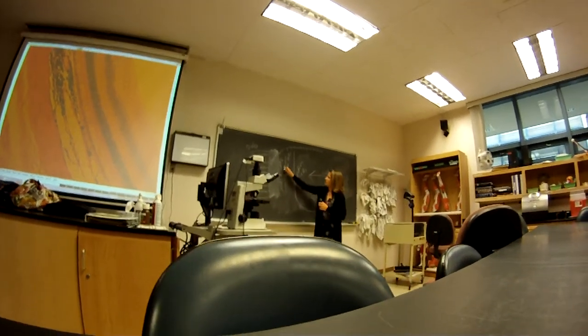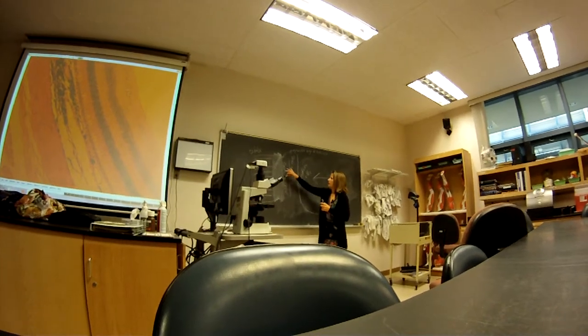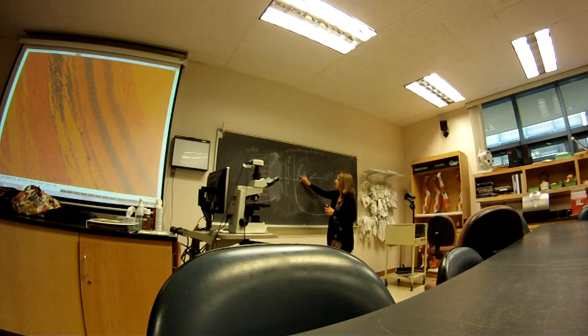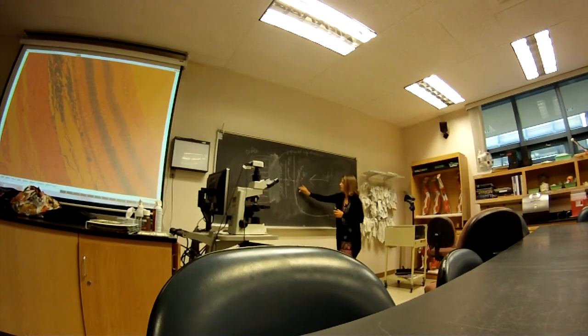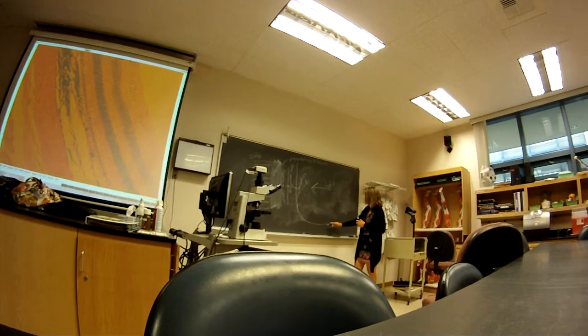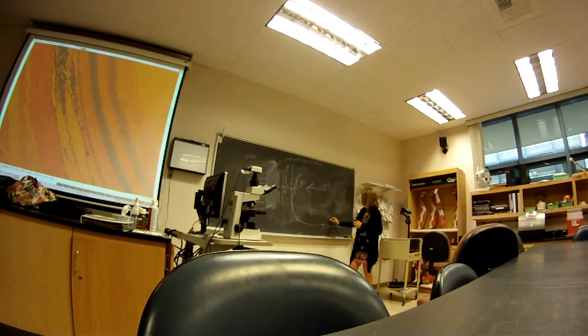Okay, right? These are your receptor cells, the rods and cones photoreceptors. They're stimulated by that. They send that electrical signal to the bipolar cells, who then communicate it to the ganglion cells. And then ganglion cells are going to carry that, where you have all of the axons synapsing with your next neuron right here at the optic disc, where you have the blind spot.